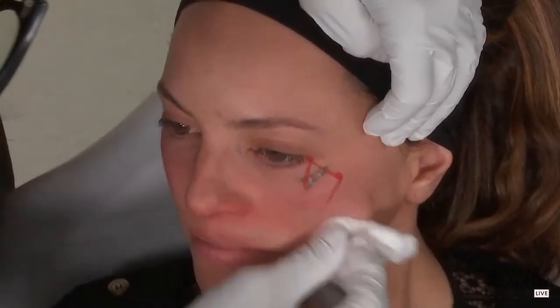Yes, if we are looking at the malar mounds, meaning the swelling in the malar area, in my point of view, if you are not an advanced injector, you need not inject hyaluronic acid in this area. Because if you are deep, like you saw with Francesco, there is no issue, but if your product goes a little bit superficially, you will have the risk to attract some water in an area where you have a swelling. So you will do the opposite of what you want to do. So you need to be advanced.